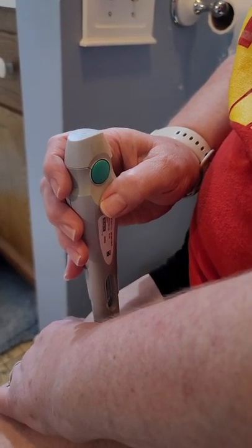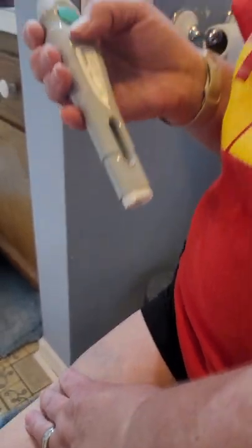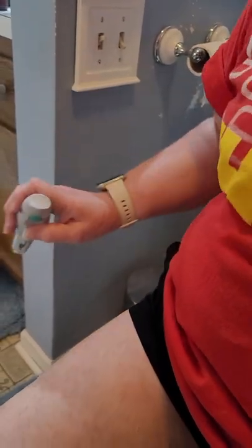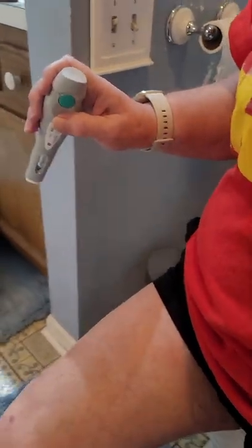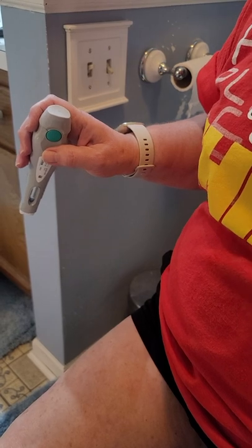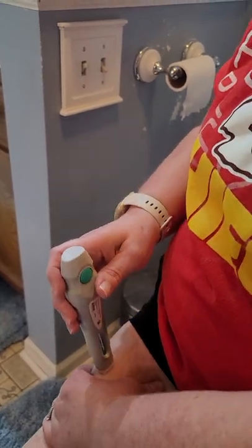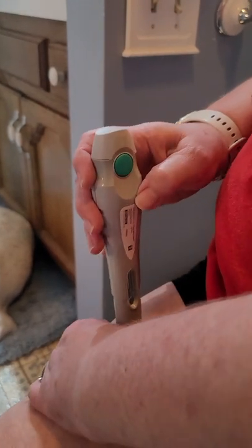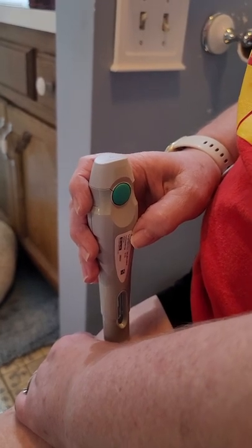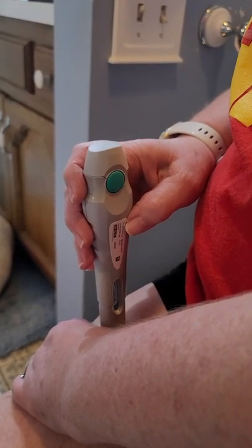Slow your heart rate down. Almost ready. My pulse is pretty high. We are going to pinch our skin, and then we're going to push the white down, and then we're going to push the green button at a 90-degree angle, and then we're going to wait almost 15 seconds. Alexa, play my money don't jiggle jiggle.